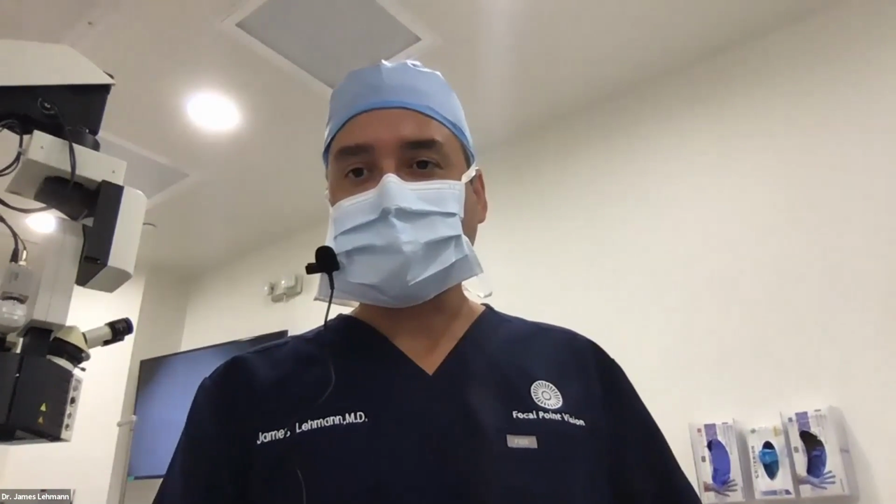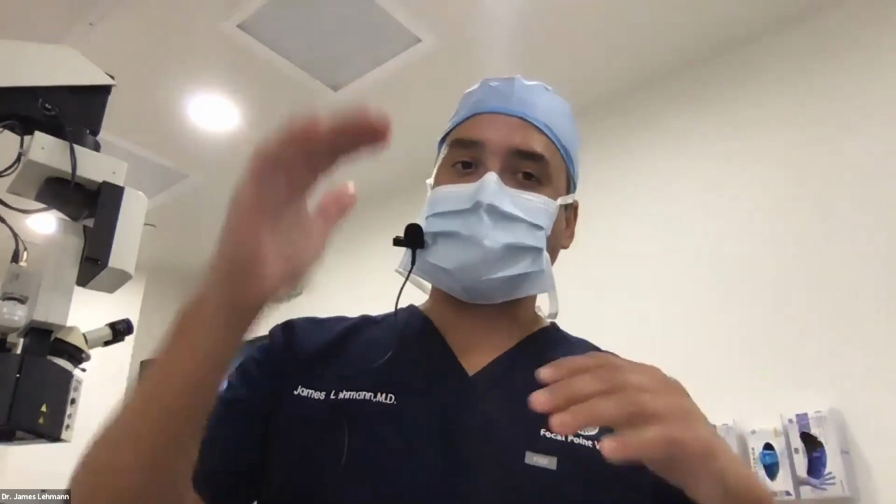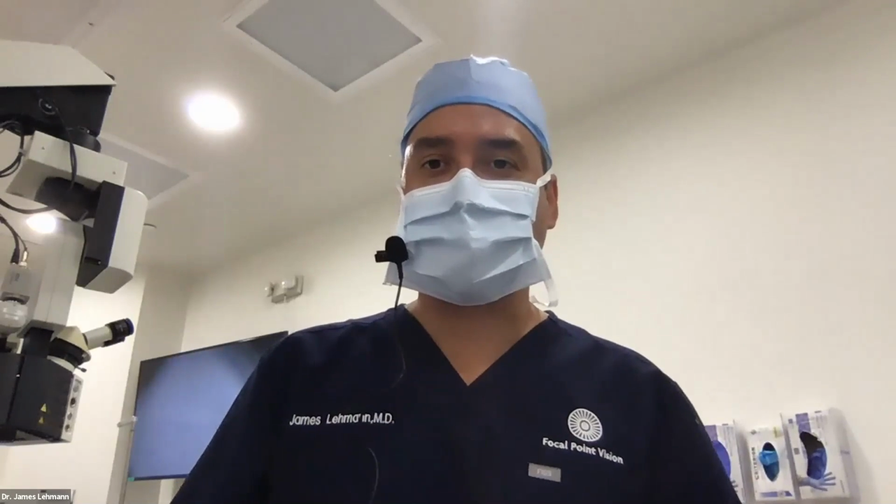Anonymous attendee, I have a question about the settings of phaco in this case. Again, I wish I had the overlay so you could see them, but we were not able to get that set up. It was making the video look kind of wobbly.